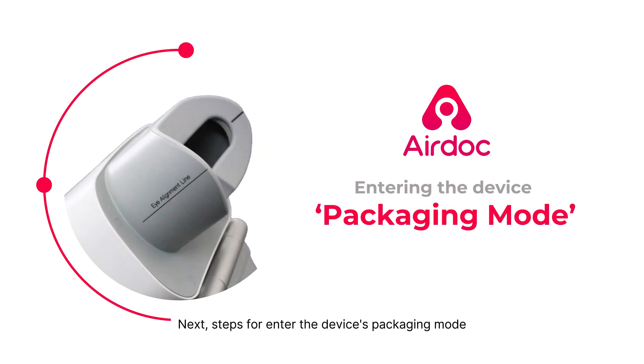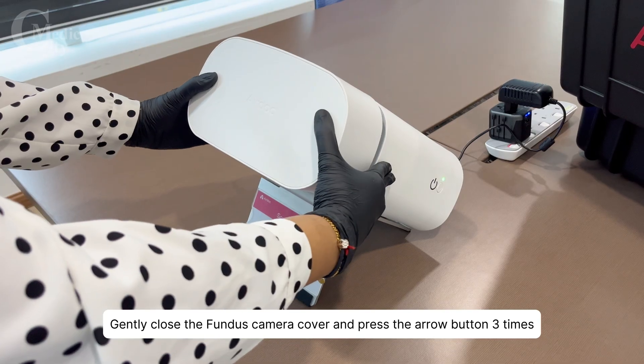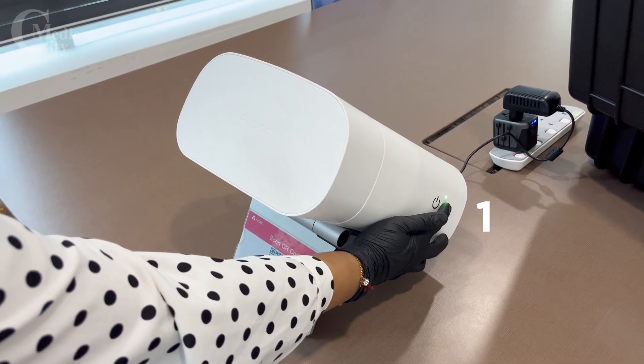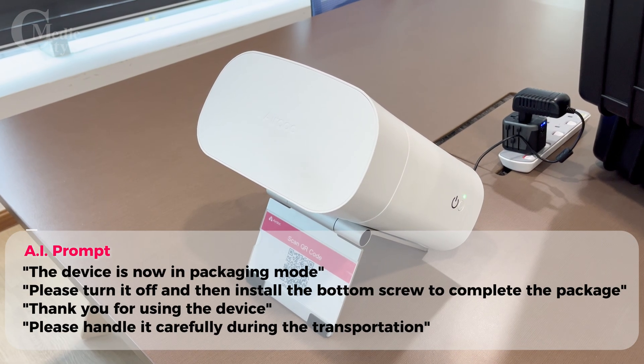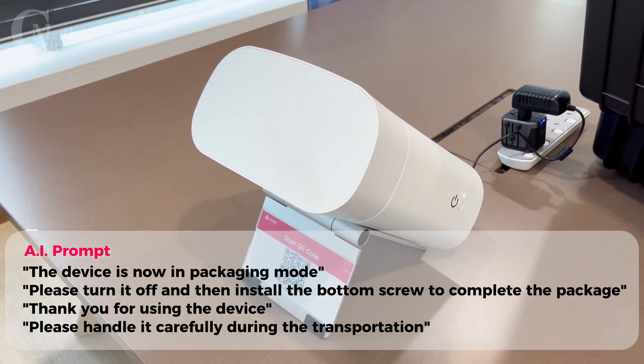Next, steps for entering the device's packaging mode. Gently close the Fundus Camera cover and press the arrow button three times. The device is now in packaging mode. Please turn it off and then install the bottom screw to complete the package.